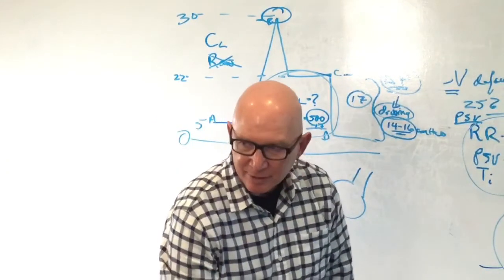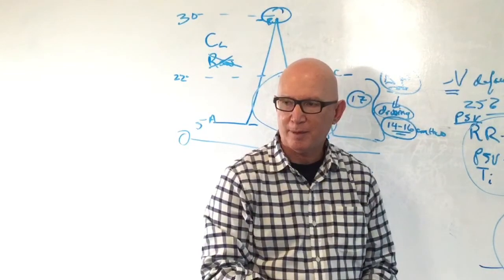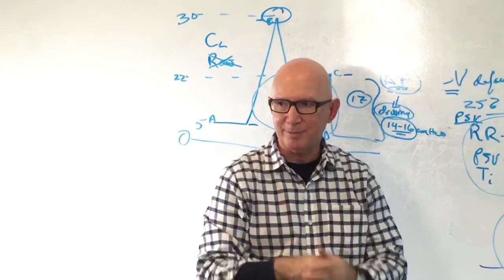Okay, so are there any other questions, Sean? Kelly Shepard wants just to clarify that plateau pressure minus PEEP equals driving pressure. Correct. Yep, that's exactly it.